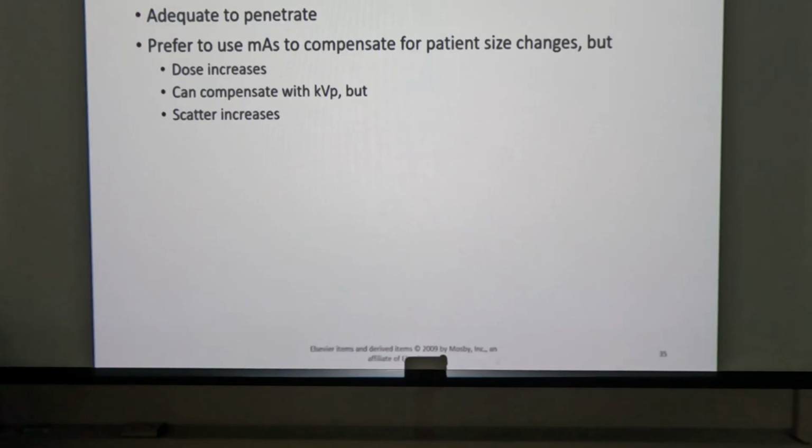Because as you increase kVp, you increase the scatter towards the image receptor. So if you increase kVp in a structure that already creates a lot of scatter radiation, soft tissue, then you've got soft tissue and high kVp both creating more scatter radiation that would emit from the patient. And therefore you have a compounded difficulty, right? So you've got scatter on scatter reducing contrast.